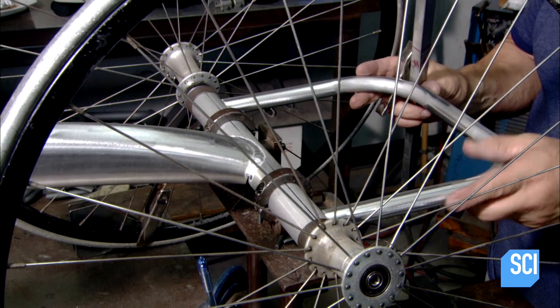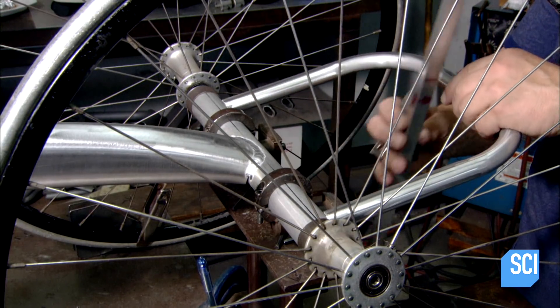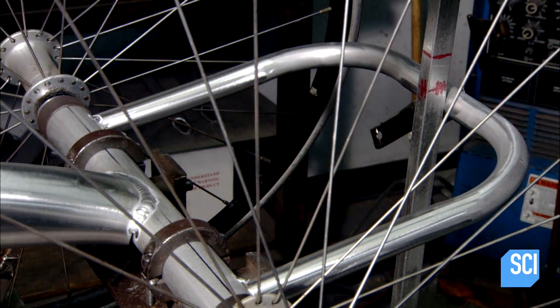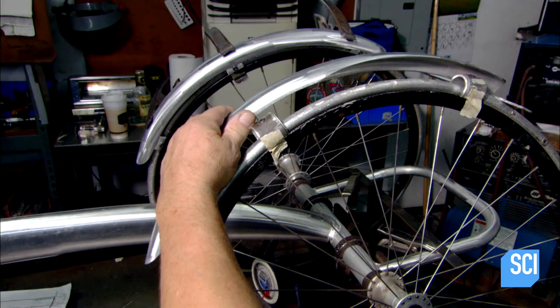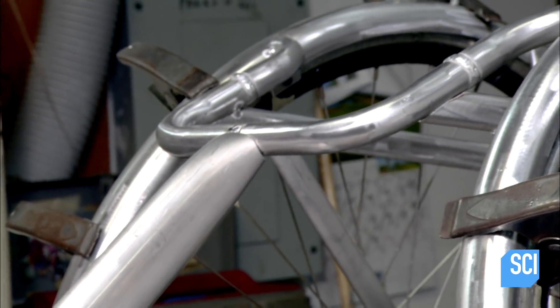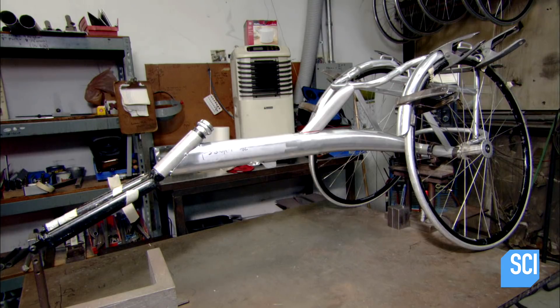He positions the seat frame on the rear axle and does a few more welds. Finally, he installs fenders on the wheels. The main framework of this racing wheelchair is complete.